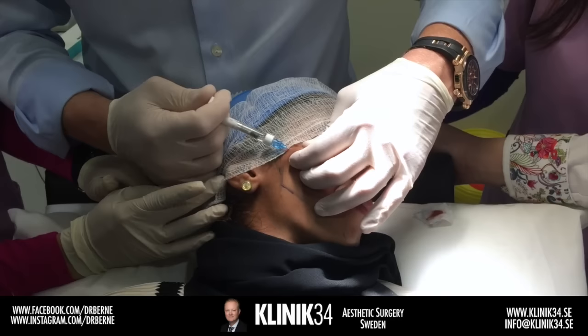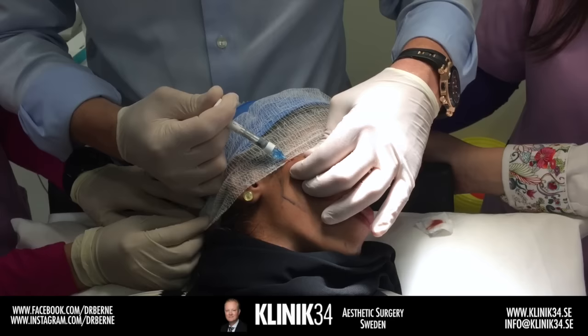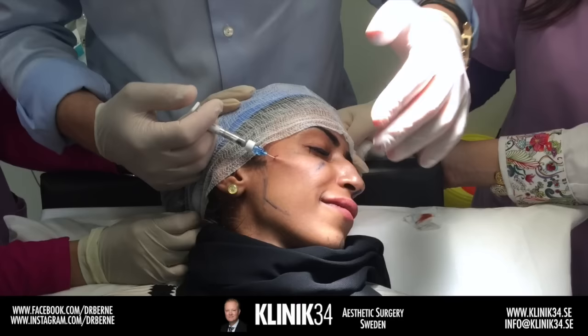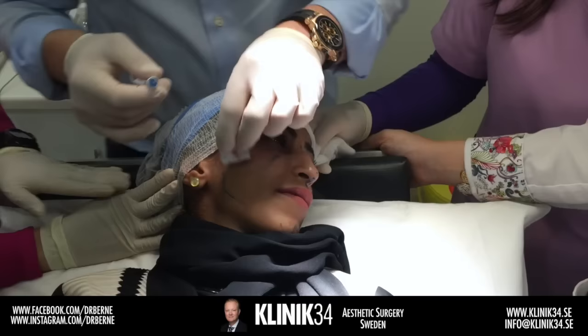We talked about this earlier regarding making treatment plans — when we do fillers we have a building-up phase. We want to build up the result, which takes more visits, more syringes, more needles, more money. This patient has a wedding in one month, so we have to hurry and do a lot at once; otherwise we would have divided the different treatments.